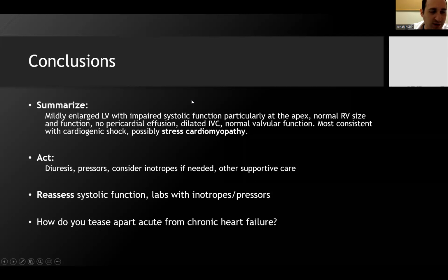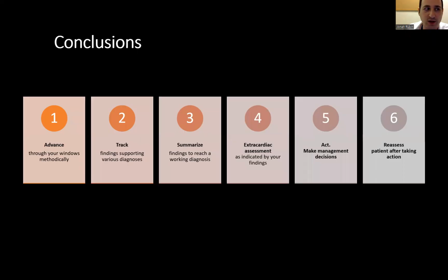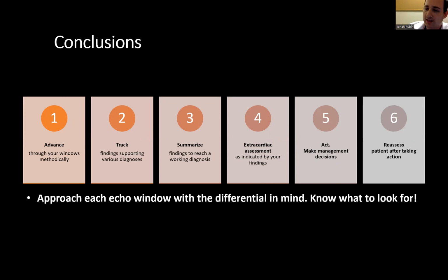Hopefully this has demonstrated for us how using the echo will guide and narrow your differential, how the more skills you have with your echo, the more it can do for you, but also how the echo is not the only solution for most of these problems. And so just to conclude, this is again our summary slide for the way that we're methodically, without any rocket science, using the echo to assess undifferentiated shock.